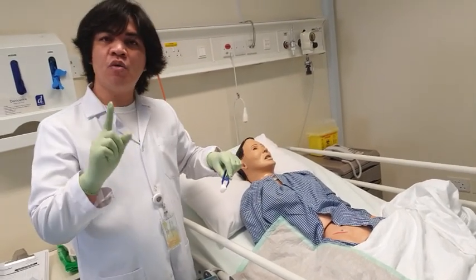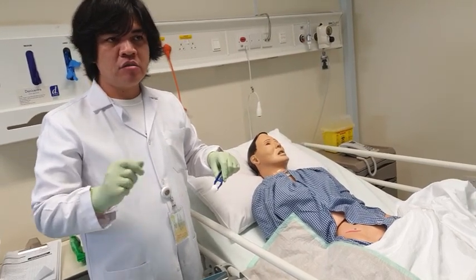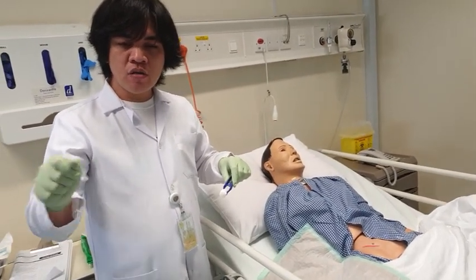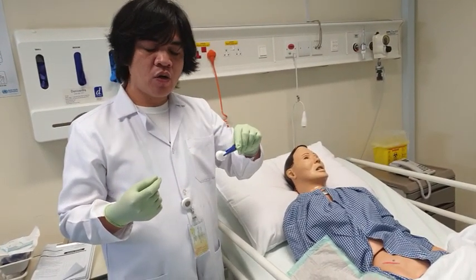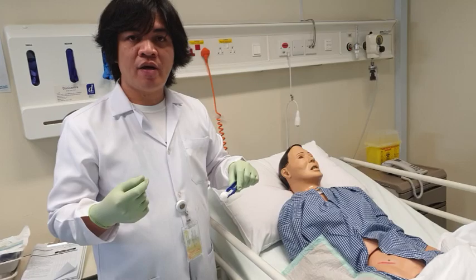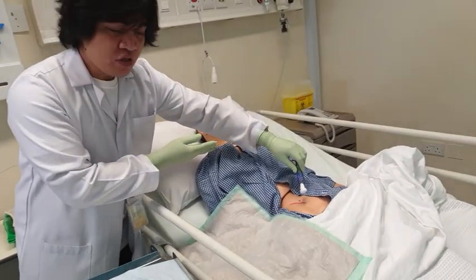Observe that I'm using one gauze in every stroke. Why? Because we do not want to clean the wound forward and backward with the use of the same swab or the same cotton, because you're going to cause infection to our patient. So we're done with the center. I'm going to the other side.